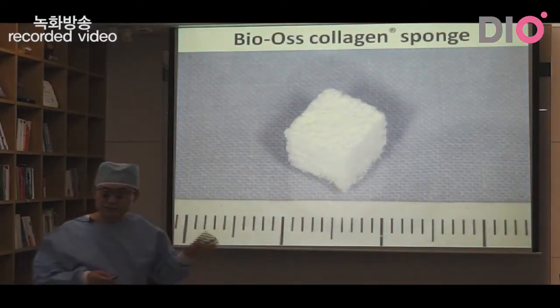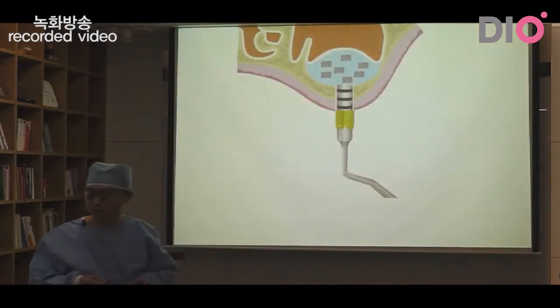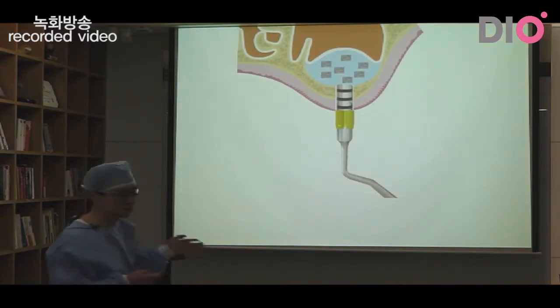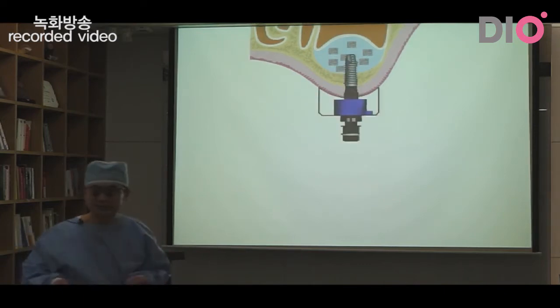This is the graft material that I will use in the sinus cavity. The collagen sponge, Bio collagen sponge, will be placed into the sinus cavity, and then implants will be placed.